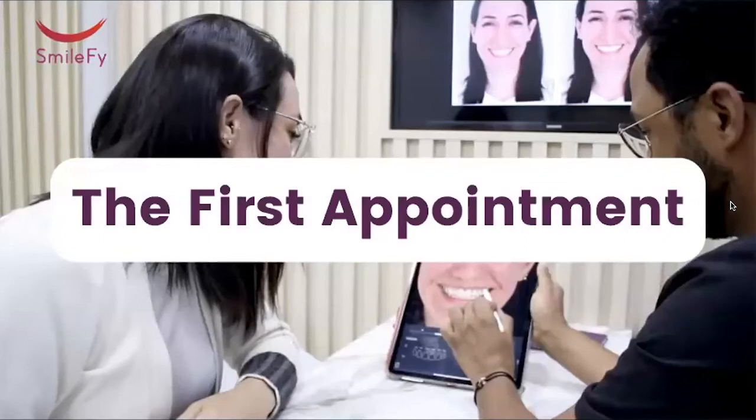So beginning with the first appointment, this webinar is based on this software called SmileFy, and SmileFy is available on the App Store, and you can download it for free and try it on one of our trial patients if you like to.